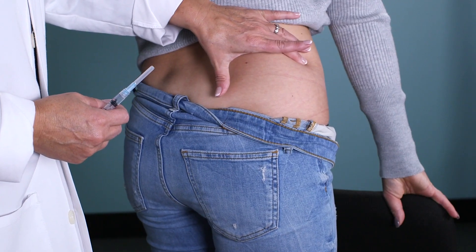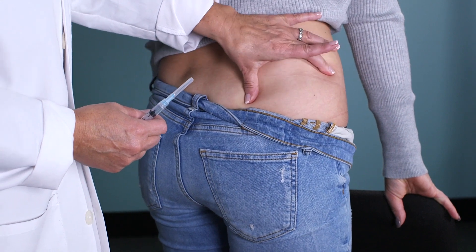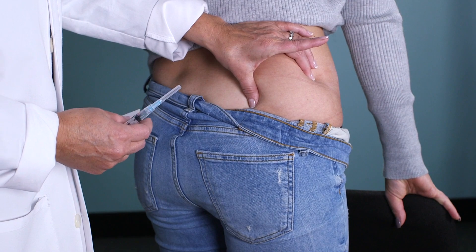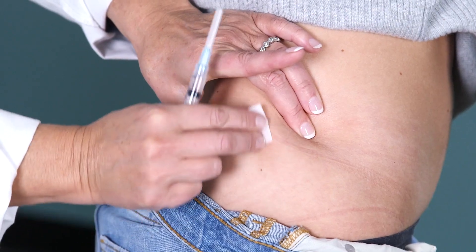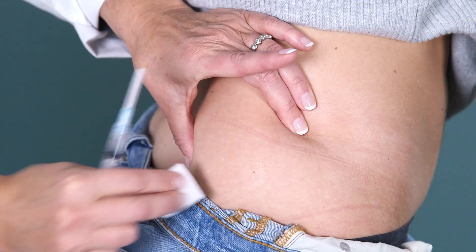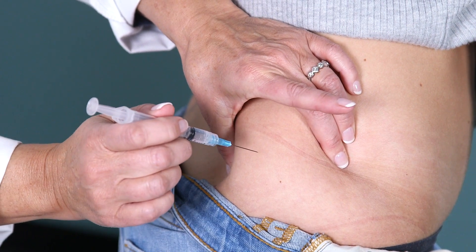Find your landmarks from the top of the hip bone, drop your thumb back and give a squeeze, or you can spread the skin taut. Alcohol wipe the area, let it dry, and use a quick dart-like motion.